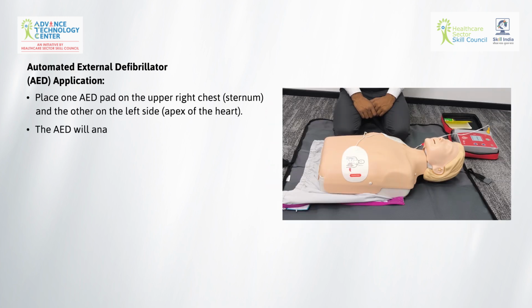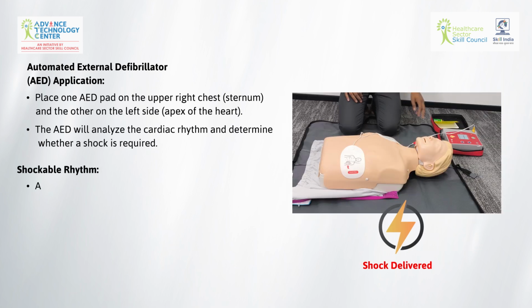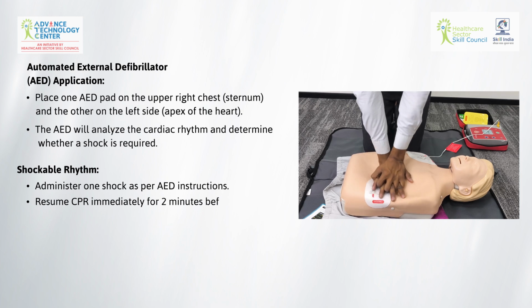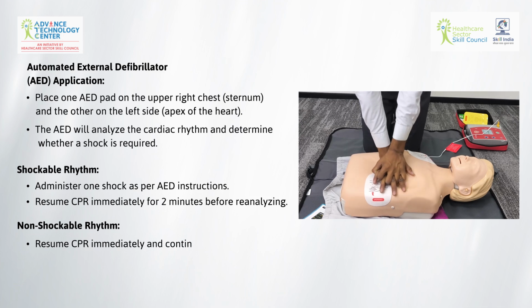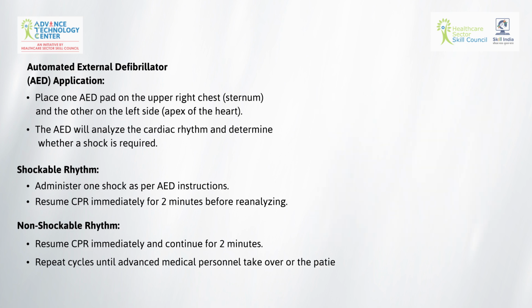The AED will analyze the cardiac rhythm and determine whether a shock is required. Shockable rhythm: administer one shock as per AED instructions. Resume CPR immediately for 2 minutes before reanalyzing. Non-shockable rhythm: resume CPR immediately and continue for 2 minutes. Repeat cycles until advanced medical personnel take over or the patient shows signs of life.